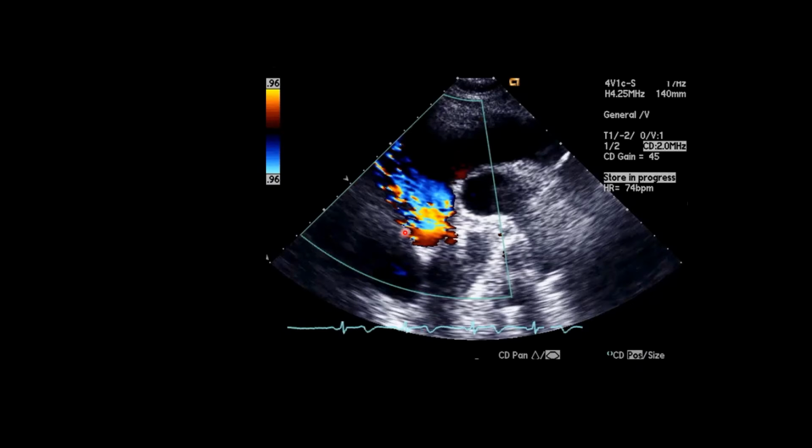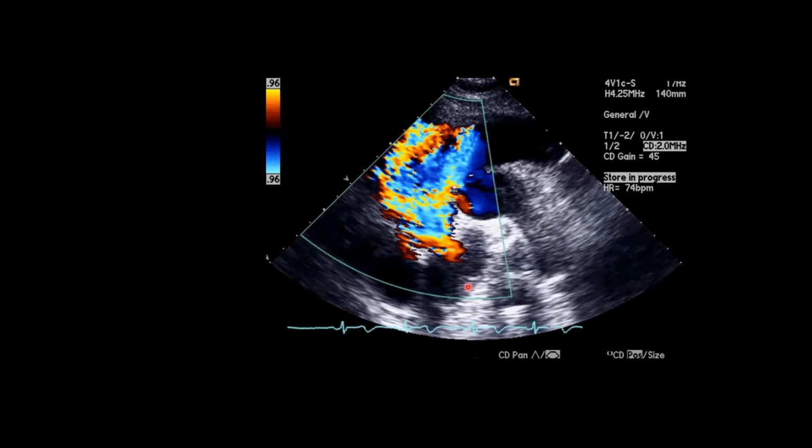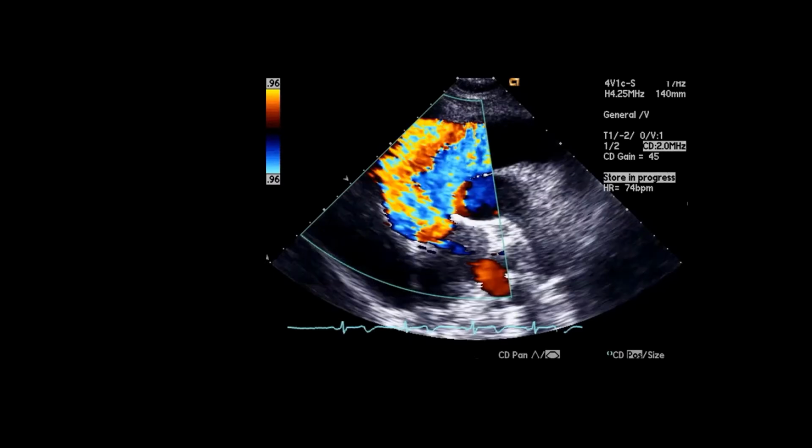So here's our introductory frame. We can see systole is just getting started. There's some swirling going on in the ascending aorta. And here we can see some disturbed flow. Looks like we're seeing some circular motion here. And the jet is starting to form. We see the turbulence. Again, the swirling where the blood is coming back and joining the jet.